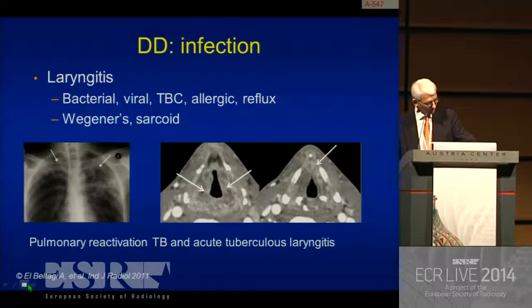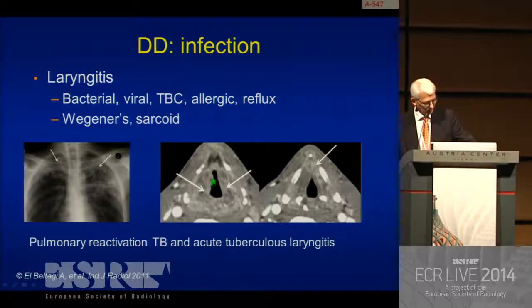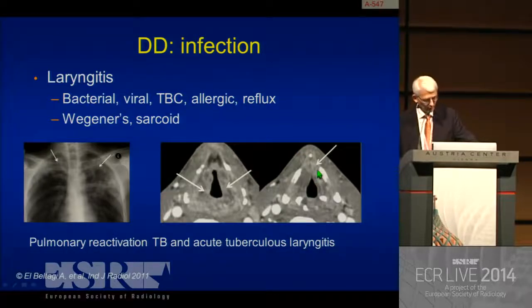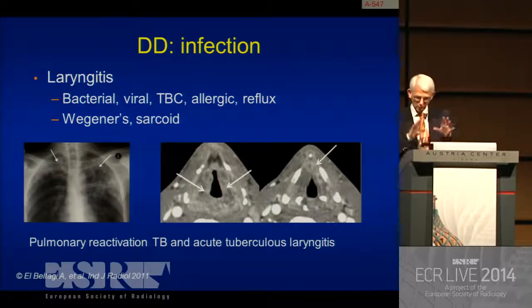This is from our colleague from Kuwait City, Ahmed Elbetagi, who wrote about this patient with a pulmonary reactivation of tuberculosis but also with an acute tuberculous laryngitis. This is at the level of the false vocal cord. Normally we would expect fatty density in the paralaryngeal space, but here we see nodular enhancing lesions, probably submucosally concentrated, and in the true vocal cord area in the anterior commissure, another enhancing nodular lesion. This could be cancer or amyloid or other diseases — of course you need a biopsy, but you have in this particular patient a clinical picture.